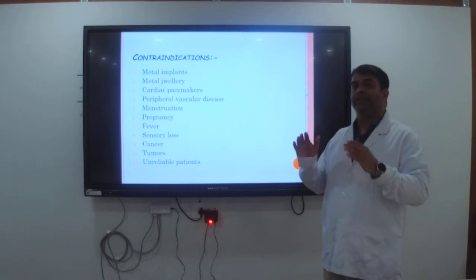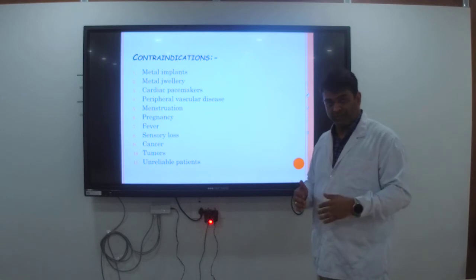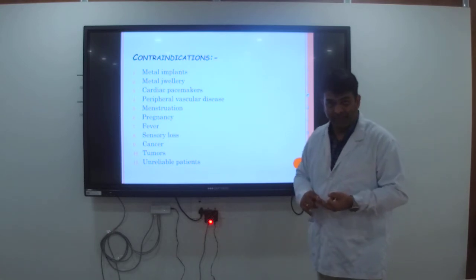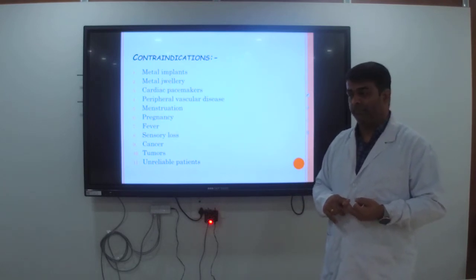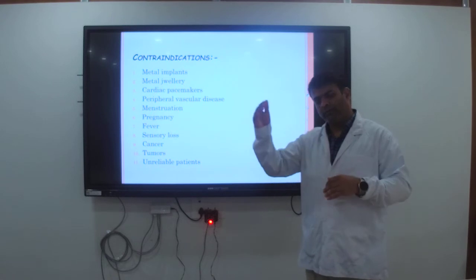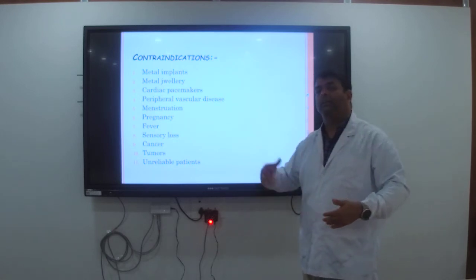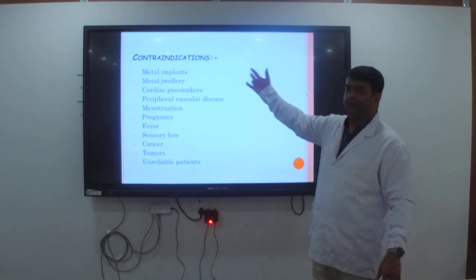For that, again, I am saying it, when the patient comes to you, you should be very much aware of his history, past history, present history, family history, whether he is diabetic, whether he has hypertension, whether he is on blood thinning tablets. You should be aware of that, and whether the patient has gone through any recent heart surgeries. So you have to get a proper, thorough assessment of the patient, and then only it will be very effective from the point of view of the therapist and also the patient if he takes a proper treatment. So the first contraindication: metal implants, definitely.